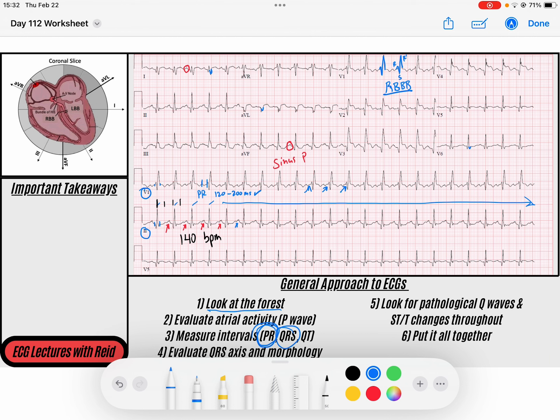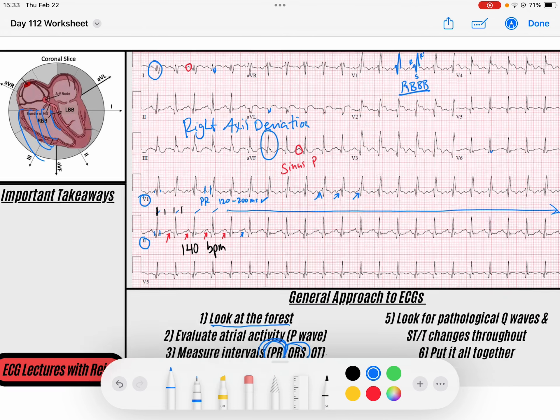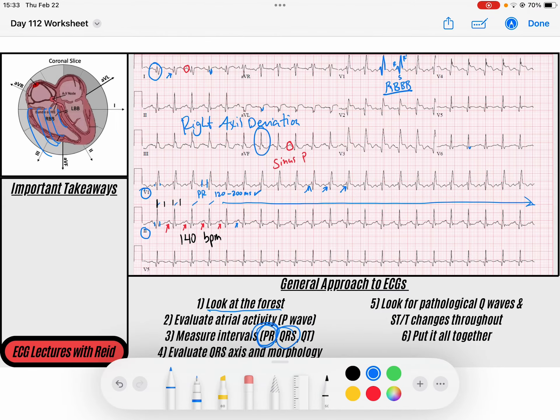Next we evaluate our QRS. We said we think we have a right bundle branch block, so we can look at our axis. Our axis is negative in lead I and positive in AVF — that tells me it's going down but away from lead I, somewhere in that quadrant. So we've got evidence of right axis deviation. Lead I is just a little bit more negative than positive, so it's a mild right axis deviation. In the setting of a right bundle branch block, we could probably expect that, but we'll continue to evaluate for other causes.